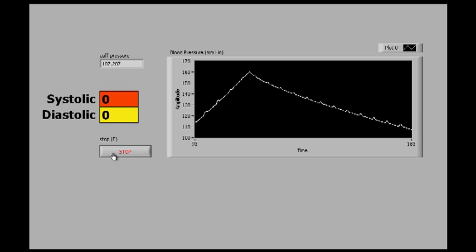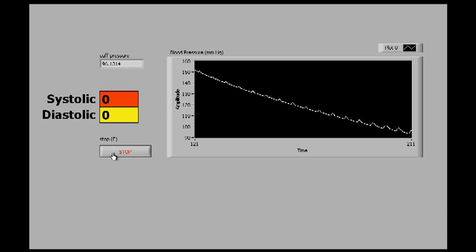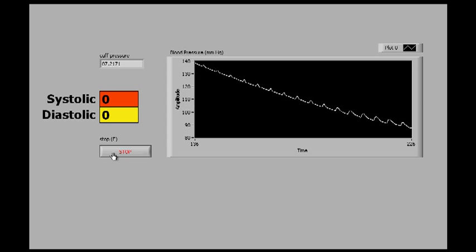At this point, individual pulses can be seen in the blood pressure trace. As the blood pressure is reduced, the amplitude of these pulses increases to a maximum and then begins to decrease.